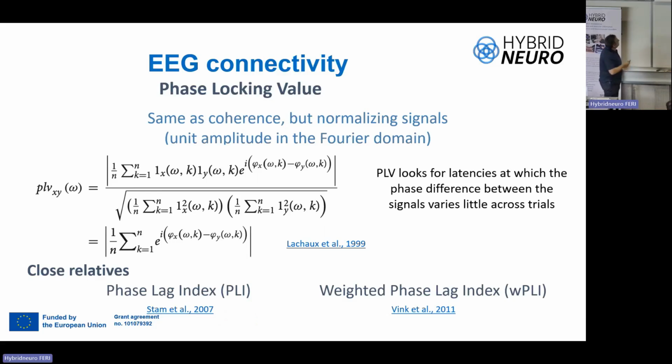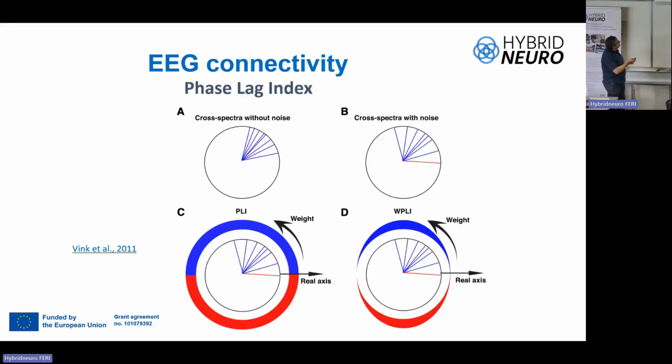There is the phase locking value, but we observe only the magnitude, the magnitude of something related to the phase. The phase of any complex number you can represent in the complex plane, like an angle, also moving along time. Usually it is in the first quadrant of the plane, between 0 and 90 degrees. When you have some noise, you can have even negative phases or more than 90.